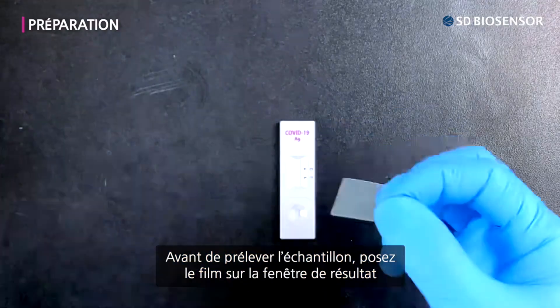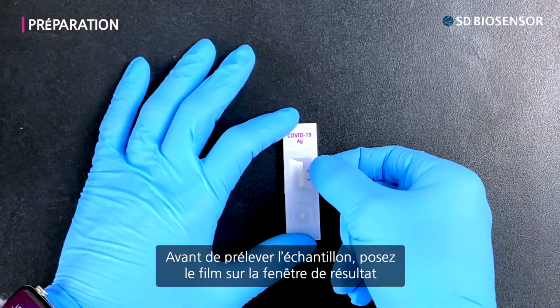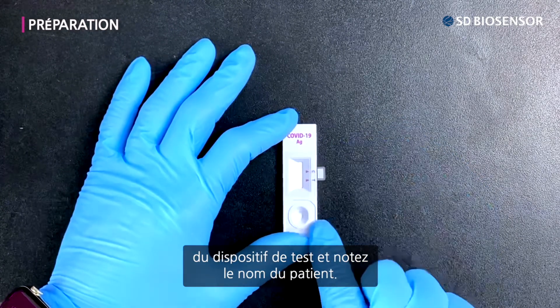Before collecting the specimen, attach the film to the result window of the test device and write down the patient's name.